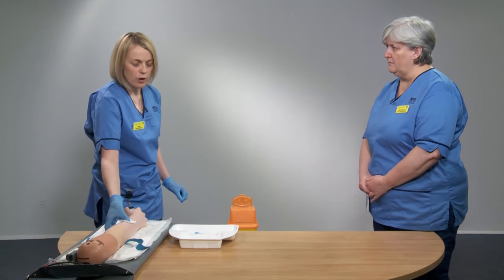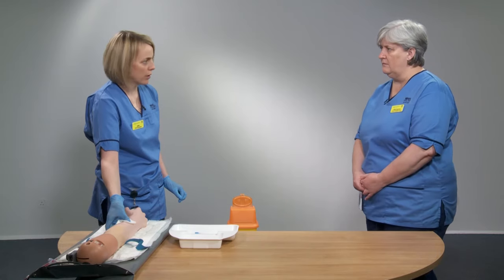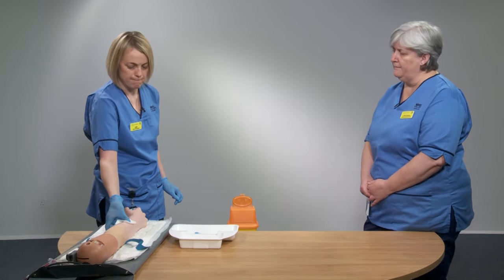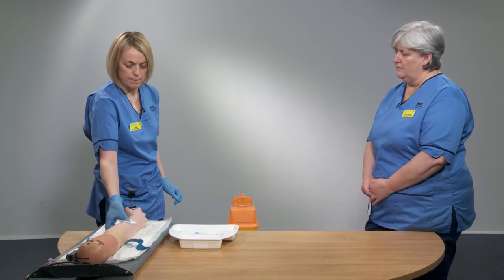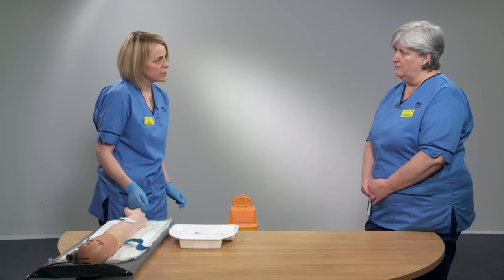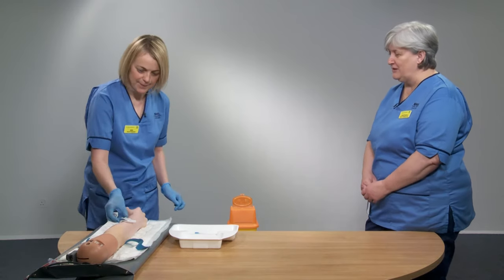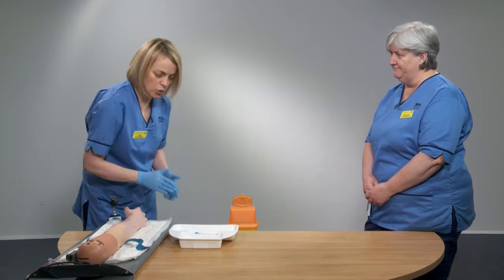Always place a white gauze swab over the puncture site once the needle is removed to stop any bleeding that may occur.